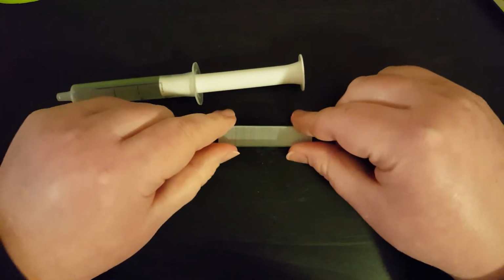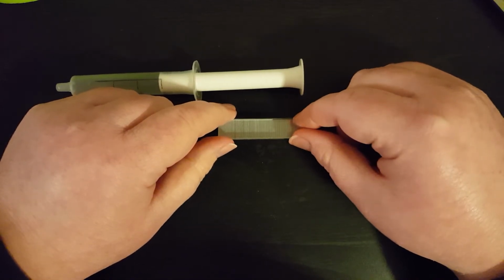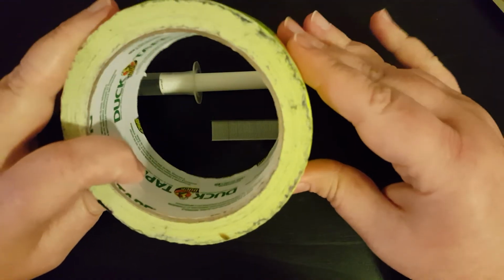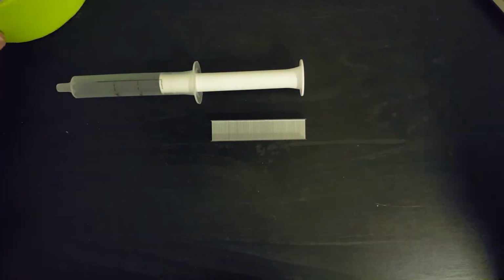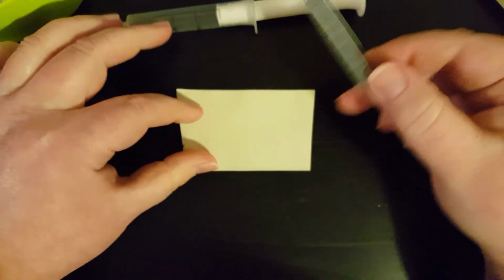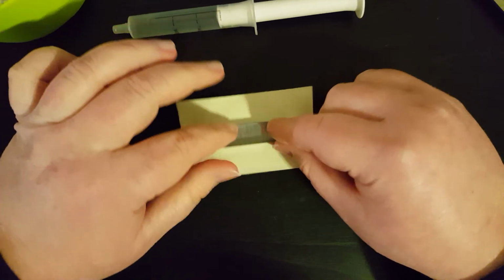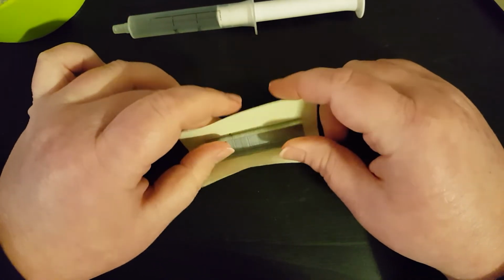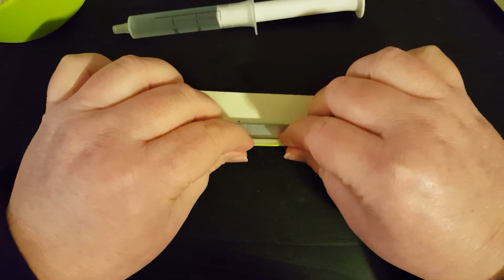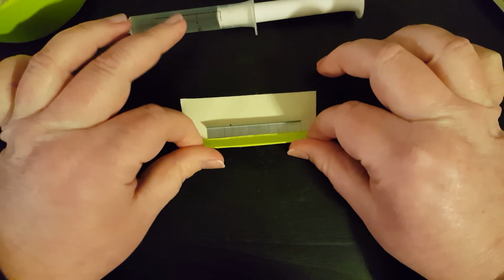Now, staples will not last if you don't wrap them in something. They'll break easily, and then your measurement will be messed up. So you could take your duct tape and tear off a piece. I've already torn off a piece, so you're going to place it, and however you can wrap it, seriously. I have a little bit of practice in this, but I'm not even going to claim to be perfect at it, okay?